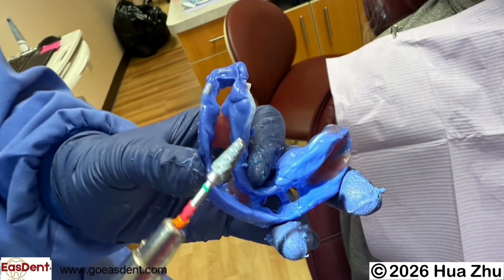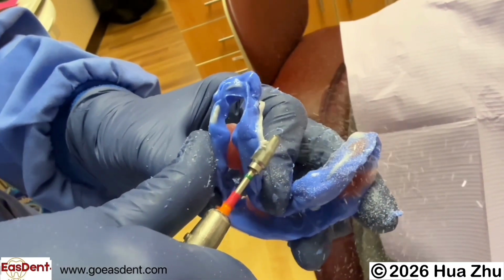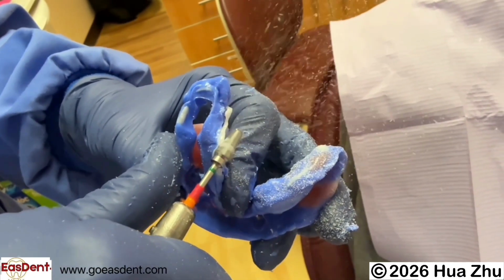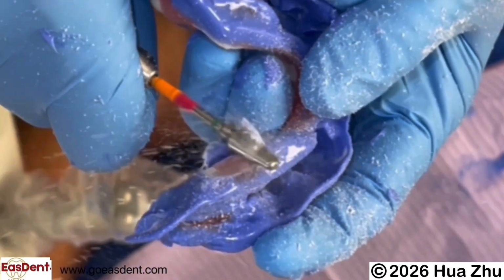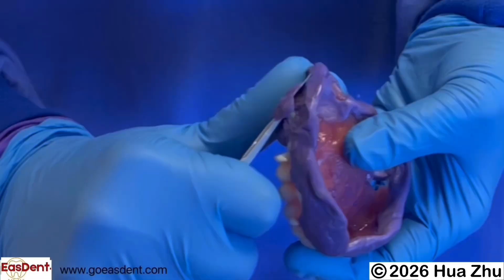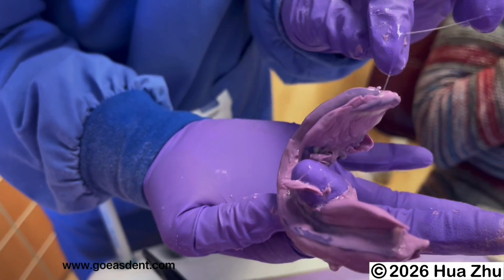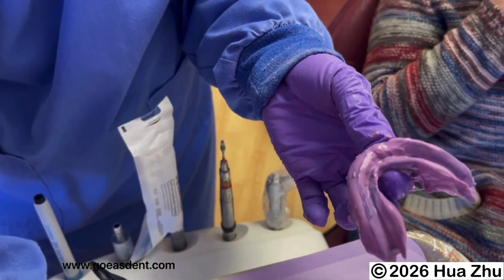After the material is set, evaluate the border. If the previous material is visible through the new PVS material with irregular shape, it may be overextended. Grind away the irregular see-through areas. You can redo border molding if the cut away area is big. Use a disc or knife to trim away the extra material. Now you have a mandibular Easdent custom tray with the teeth position and the nice border.